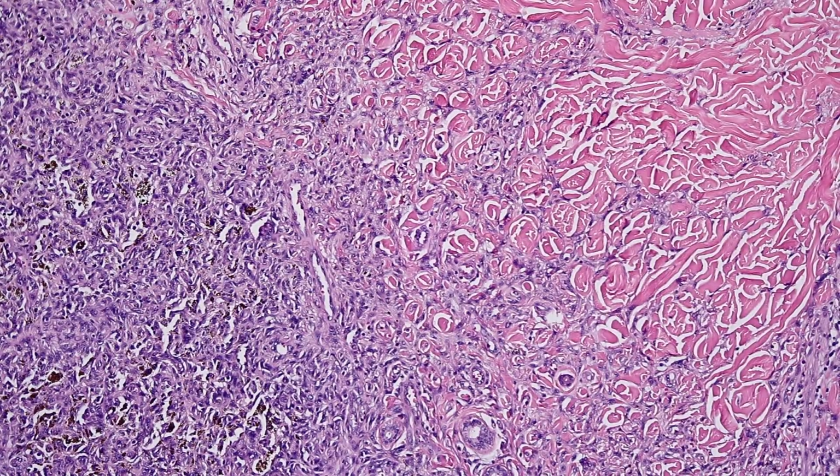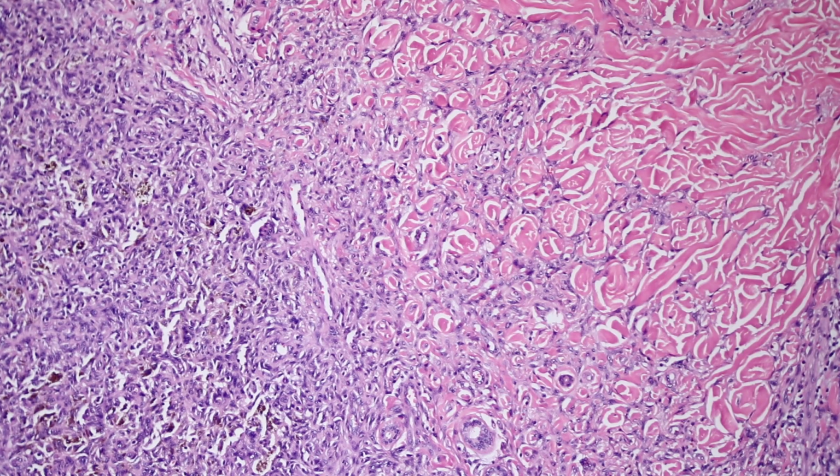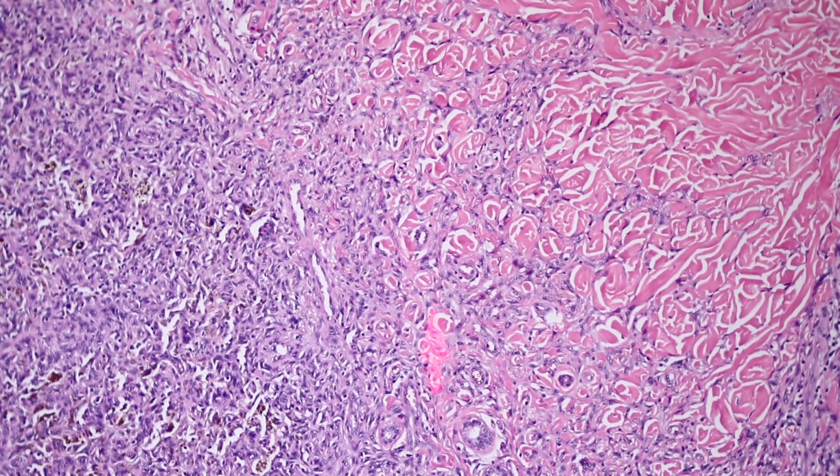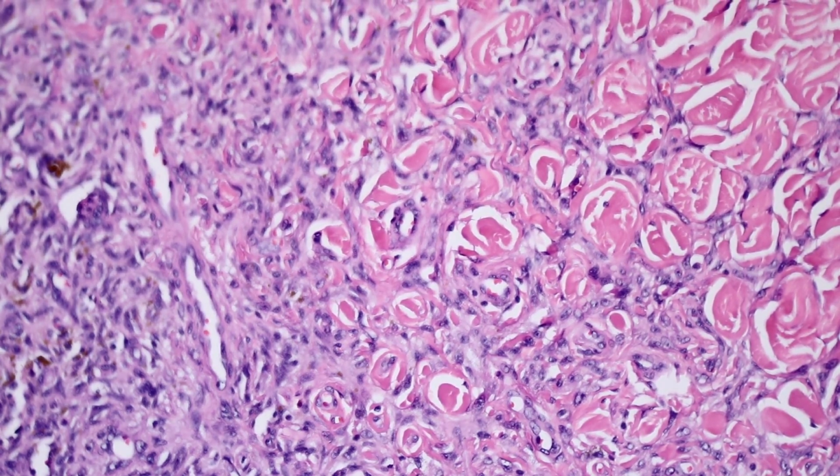And let me see if I can flip the condenser to kind of highlight the pattern here. You can really see the nice large bundles of reticular dermal collagen over here, and then here are the tumor cells, and the tumor cells are intercalating between the collagen and wrapping around and entrapping each individual one. A very nice feature for dermatofibroma. Of course, not totally specific.